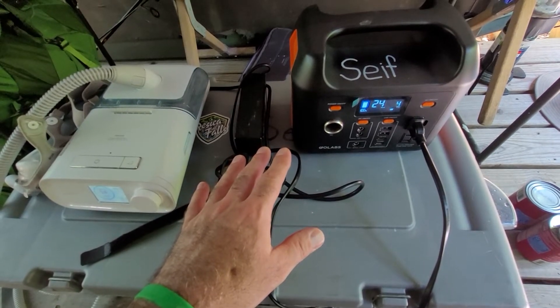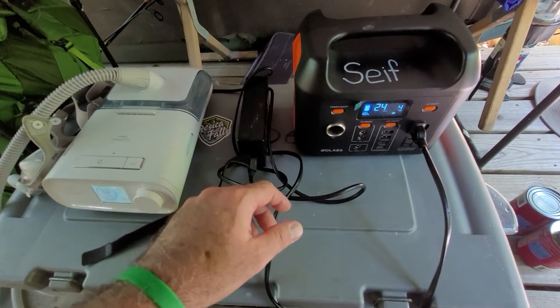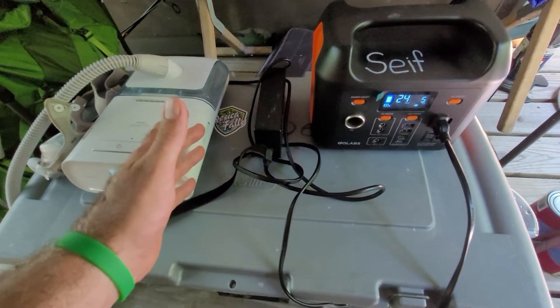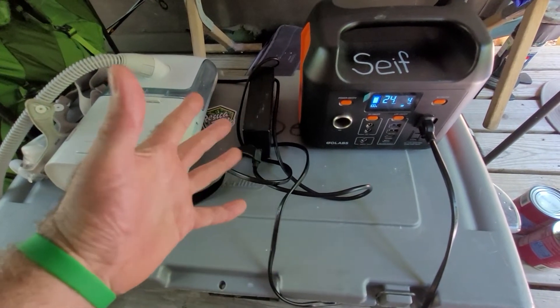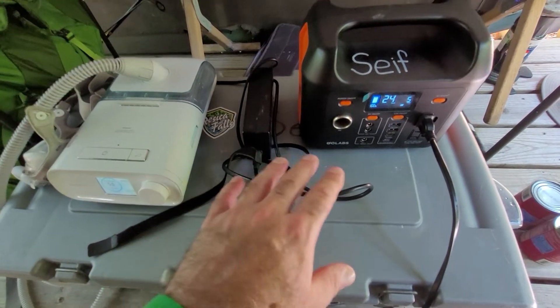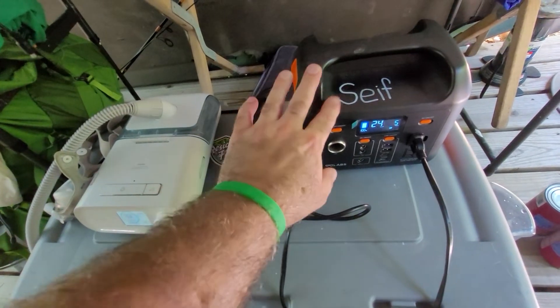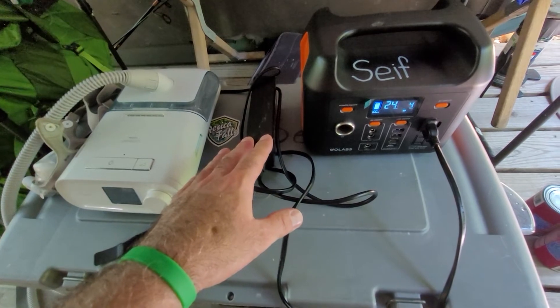I charged it up yesterday here at camp and now it's staying at 100%. The first two nights usually come from one charge, and after you've used it, it kind of refreshes itself and you get three nights out of it. One thing I've been doing is using it a couple days before to run my CPAP at home to drain it down and then charge it back up, and then it has a little bit more capacity.